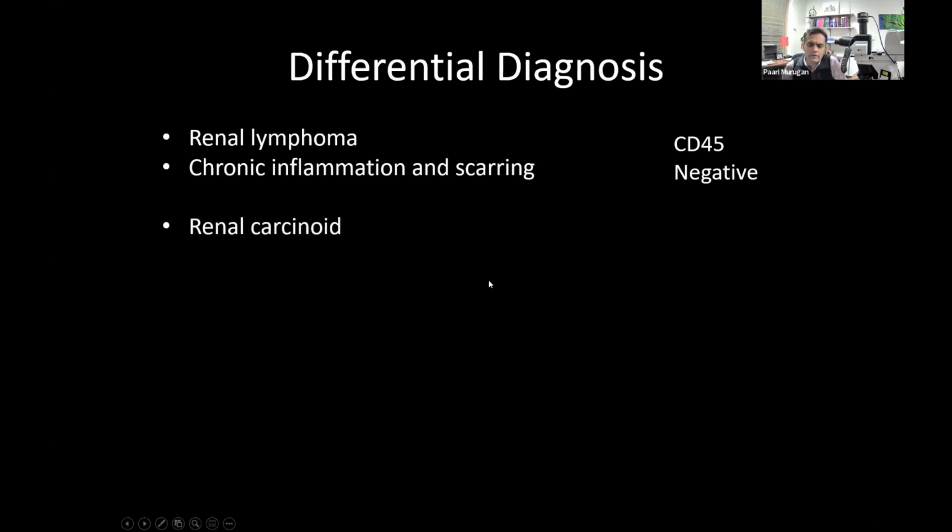So what about primary renal uncommon tumors? Renal carcinoids, these too exist. We've seen a few cases, and renal carcinoids may have these small round clusters of cells. That's a possibility, although the organization in sheets is unusual for carcinoid, and the infiltrative pattern is also unusual, but we need to consider that. And of course, we should be considering renal carcinoma, maybe with a solid or unusual growth pattern. Clear cell carcinomas often have different morphologic appearances, so we should consider that. But both of these are easily ruled out by a cytokeratin stain, which was negative in this case.